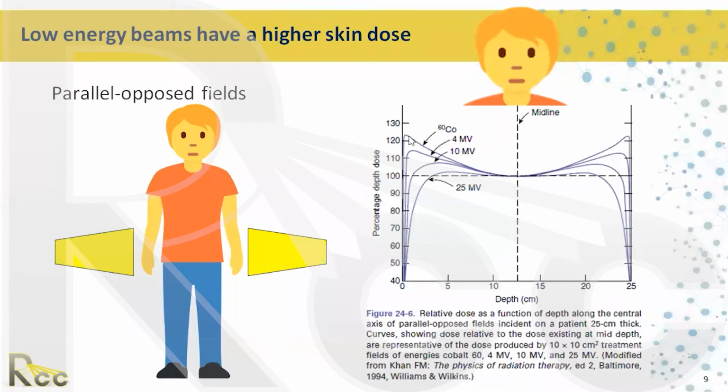As a function of energy, look at though, because the depth dose is increasing, how less the given dose, the dose at D max, begins to decrease as you go up in energy. And in this range here, look at 10 MV. How nice this is here. It's almost flat across. See that? Look at that. You give the dose here, and you only get about maybe 8% more. But with cobalt, you're giving 120%, maybe 122, 123% to the surface.